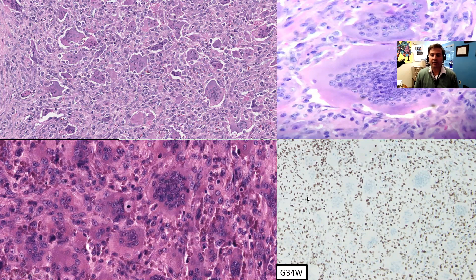However, it is only the mononuclear cells that are neoplastic, as is seen here with a G34W immunohistochemical stain. It only highlights the mononuclear cells, and you can see that the osteoclast-like giant cells are completely negative.